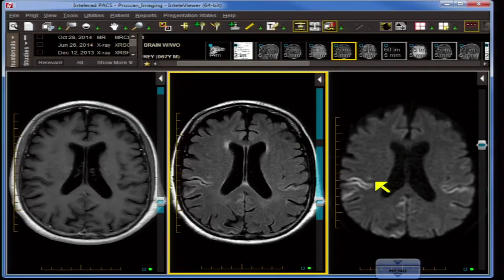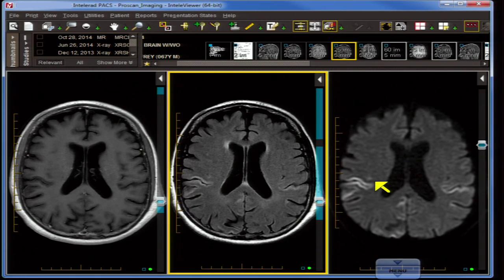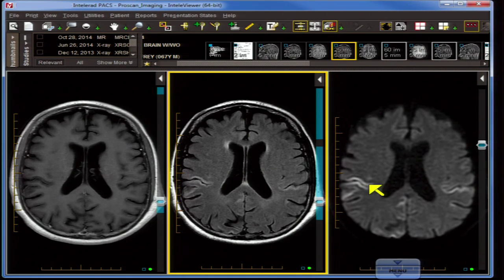This is a 67-year-old man with a gait disturbance. I am showing you on the far left a T1, in the middle FLAIR, and on the right a diffusion restriction image.